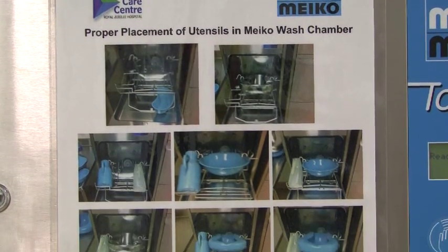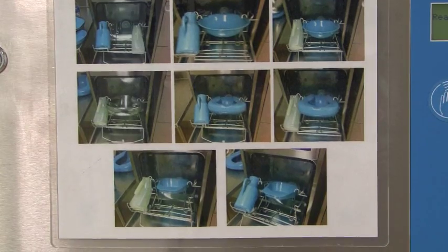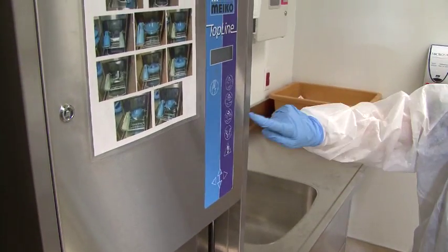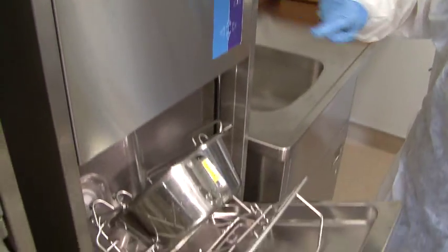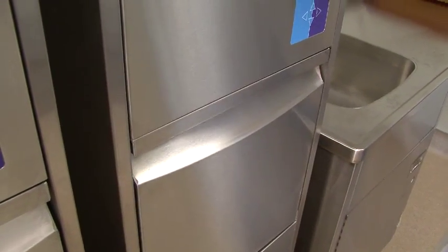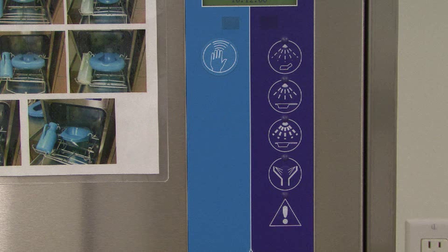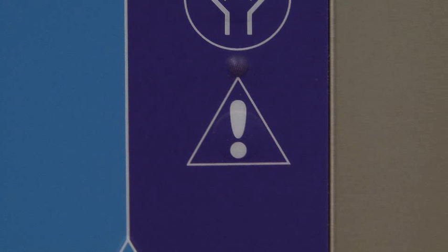A pictorial guide to loading the machine is posted on the front of the machine. To close the door and start the wash cycle, press the third button from the top on the control panel. The other three circular function buttons on the panel have been programmed to also start the wash cycle in case you press one of them by mistake.